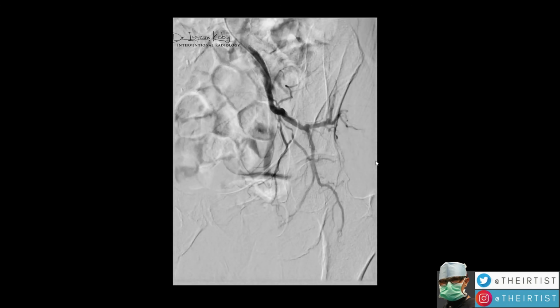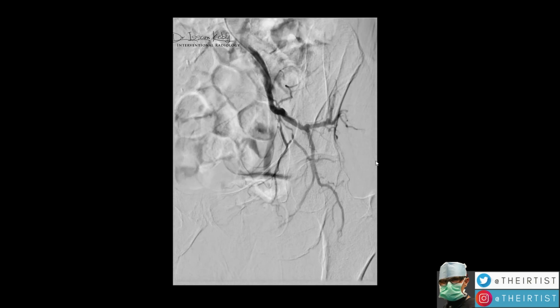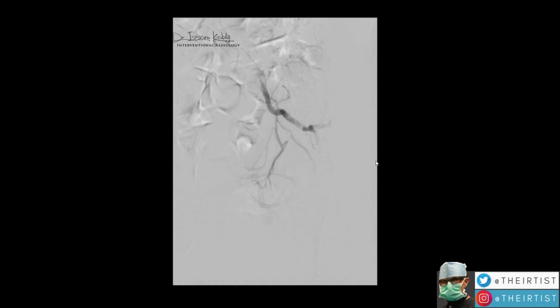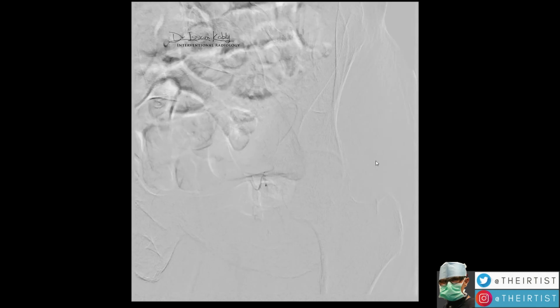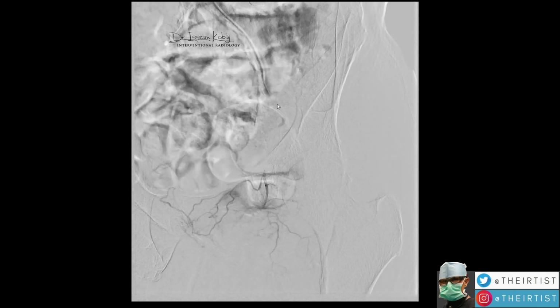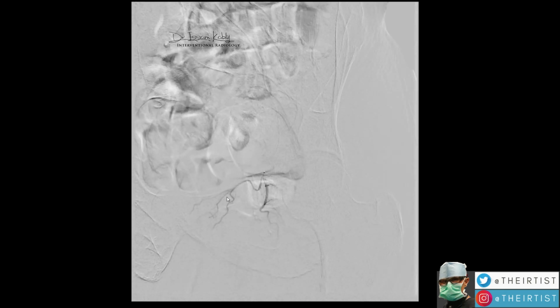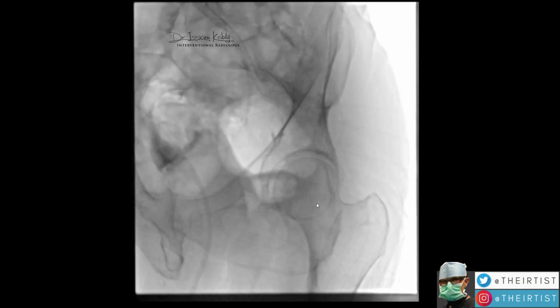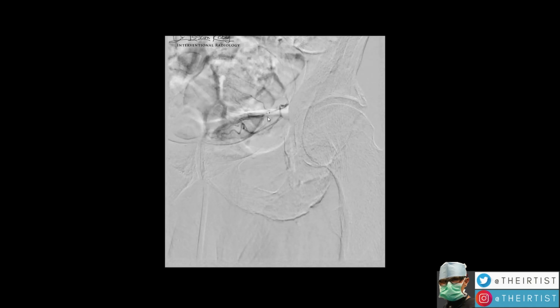The second step is what I call the technical challenge. After you recognize the artery, how are you going to get into it? So this is what we've done. It doesn't take us long. We already suspected the location of this artery, and as I'm moving forward, we get more precise, more selective angiographies. And here, this is the microcatheter. This was advanced in our target suspected vessel. So now we have only a few candidates, so we're going to go a little bit more selective and penetrate those vessels. We use advanced imaging, we use mapping, we use microcatheterization techniques to get there.